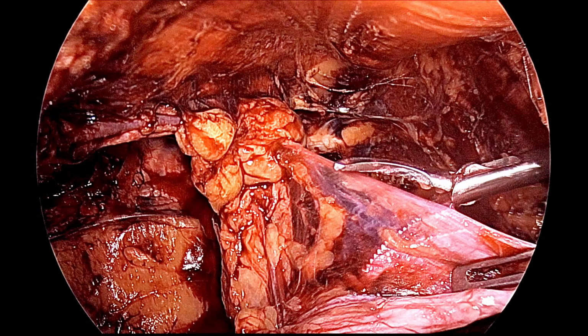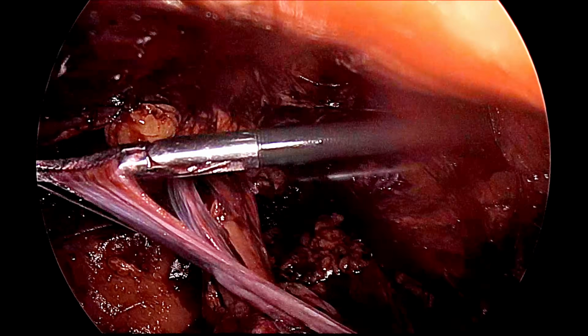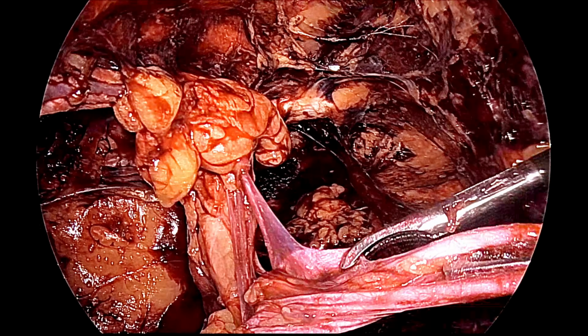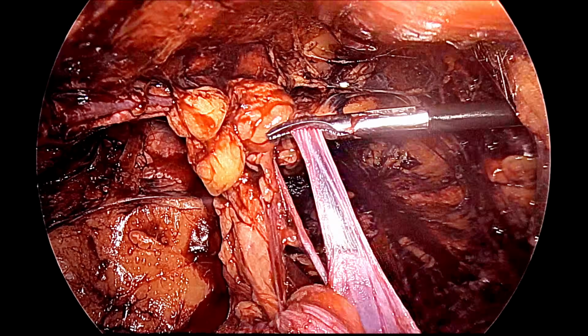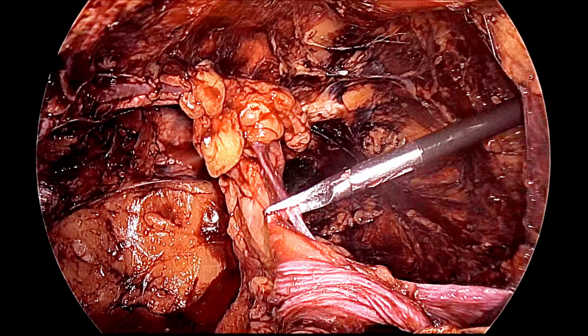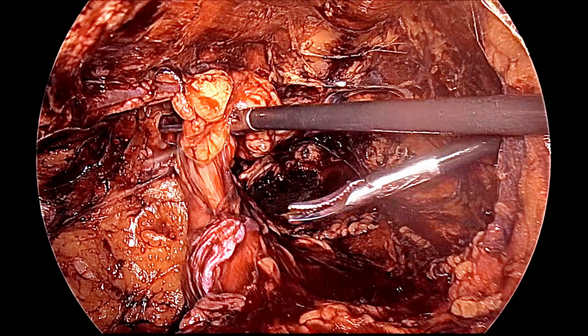So, it is almost out, just a few more centimeters. We should take care that all around the defect at least a 5 centimeter pocket should be formed all around the defect. So, that the size of the mesh, generally we should select 10 plus the defect, and the center of the mesh must be in the center of the defect, so that recurrence will not happen.